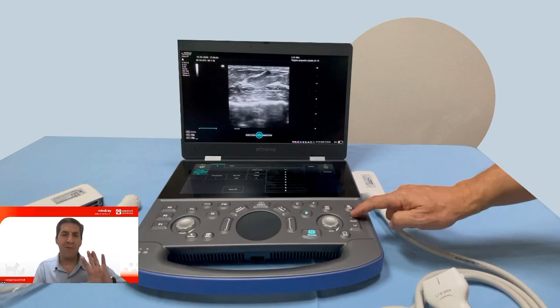Remember, we have specific presets in the ultrasound machine. However, many times we need to organize the visualization of the screen a little bit more, and we can use the gain to make the structure we are looking for more visible, or to differentiate nerves from muscle, from fascia, etc.